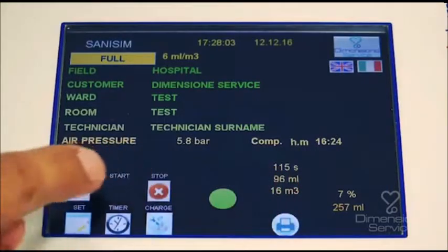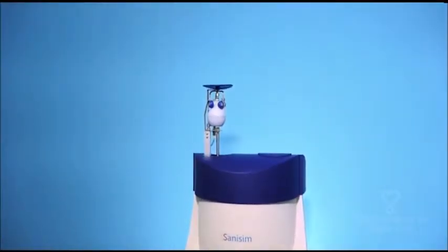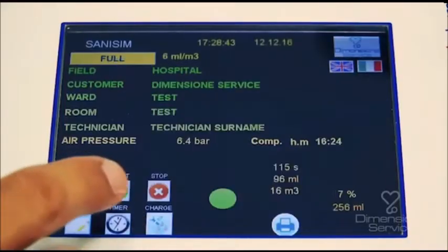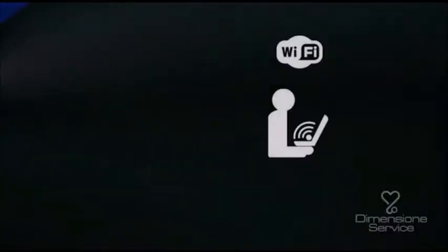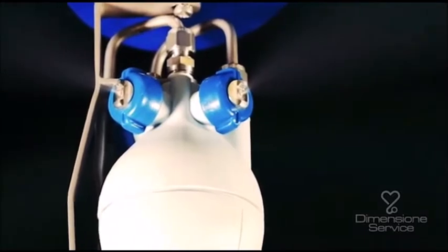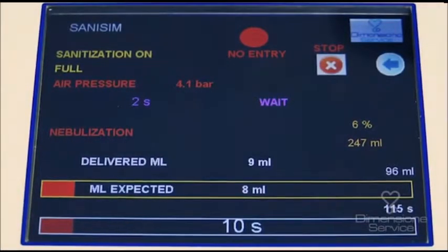When the device is ready, without any alarm, you must click the fogger icon to release the device needed to nebulize. If everything is ready, just click on Start. At this point, the device is ready to start the process that will start with a preset delay time. This can be modified. The device is programmable and can be controlled from outside through a PC connected to a Wi-Fi generated device through a normal web page. During the process, the device monitors time and the amount of atomizing liquid.